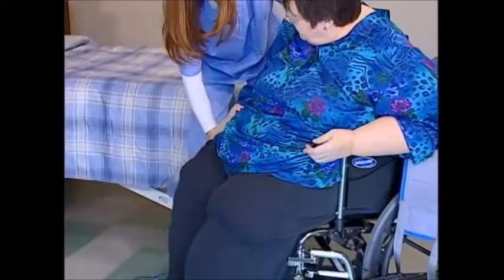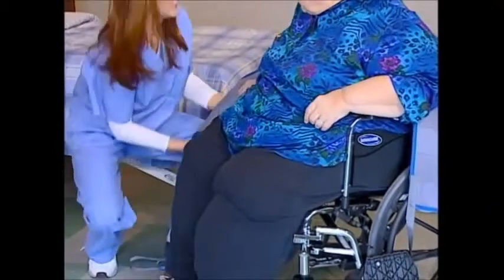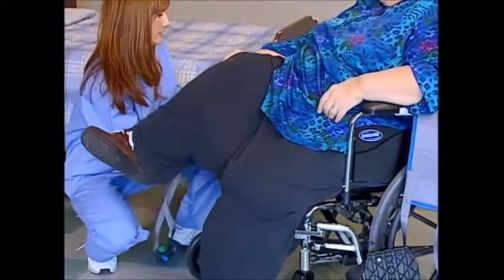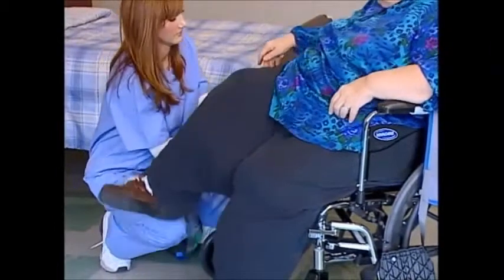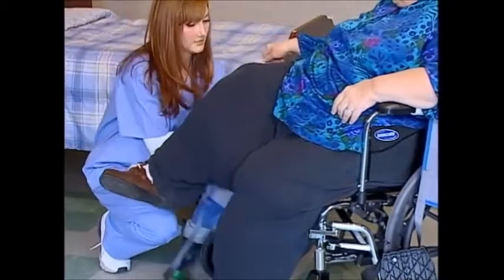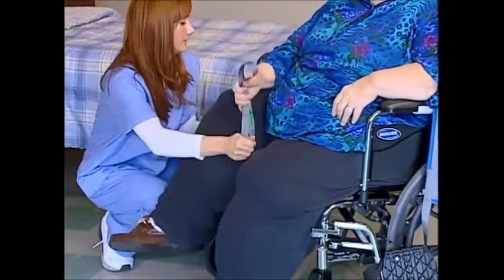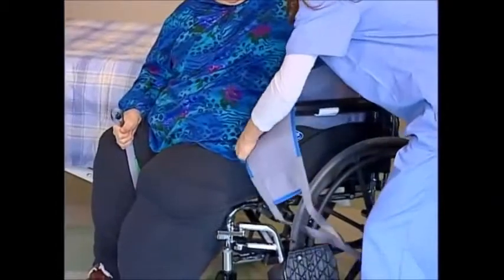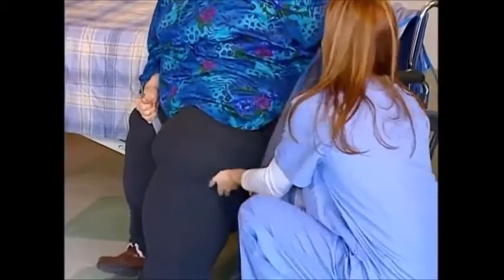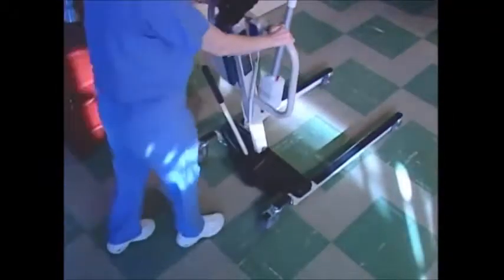Push the bottom of the sling down to the seat. Position the straps as far forward in the seat as possible. Have the resident lean back in the chair. Lift one of the resident's legs. Reach under and pull the sling out until it's just behind the resident's knee, about 3 inches. Repeat the procedure for the other leg. Be sure that the sling is clear of the wheelchair's front corners. Move the lift into place.